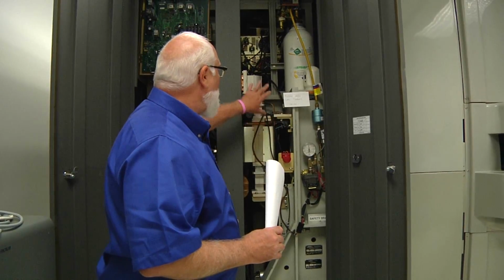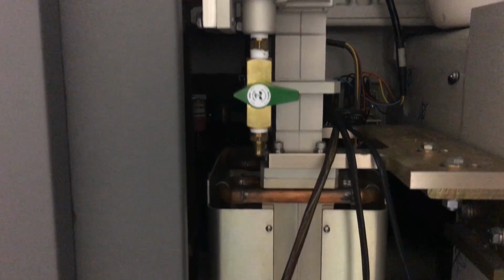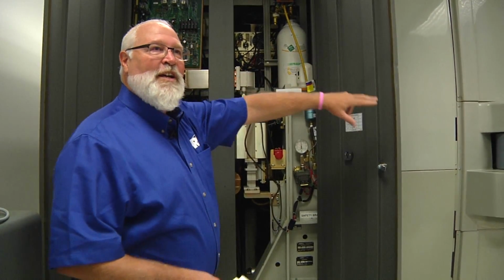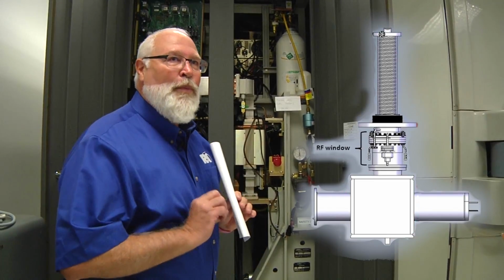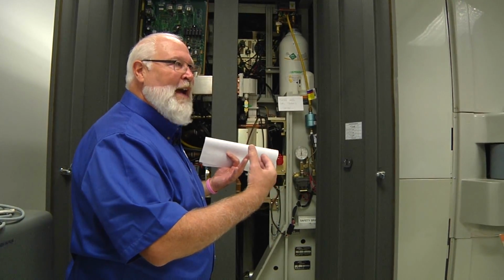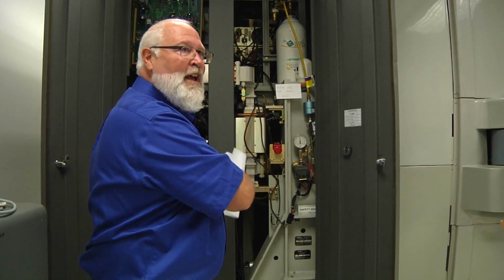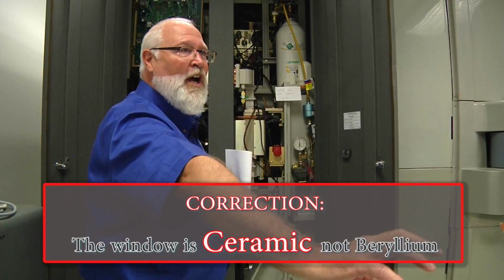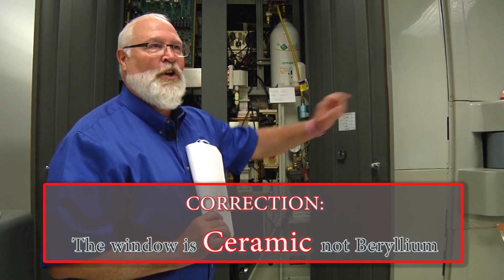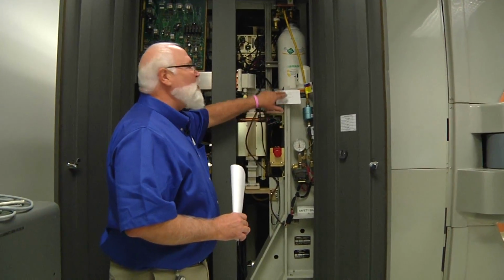So the pressure in this waveguide, this is the waveguide section here, we want at 32 pounds per square inch. If you go up to 45 pounds per square inch, I was talking about that RF window. You'll pop that window out, and the guide is at vacuum. So when you get a vacuum leak, it sucks everything in. So it's going to suck all your SF6 and all that beryllium window into your guide. And that's $250,000 to replace your guide. And you're down for a week and a half. So that's why we put these little notes on there.